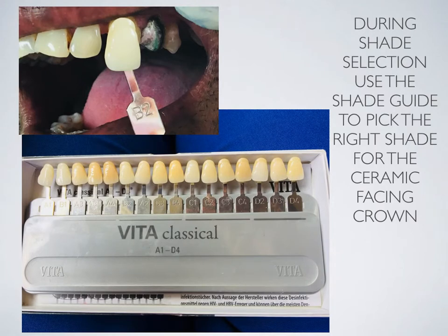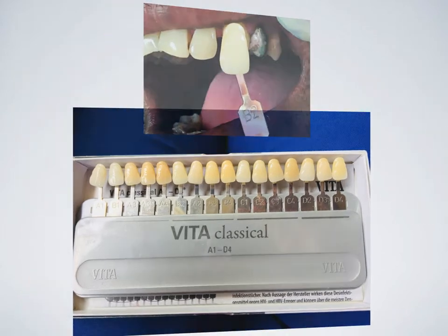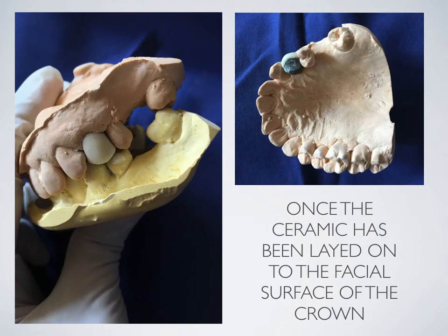During shade selection, use the shade guide to pick the right shade for the ceramic facing crown. Once the ceramic has been layered onto the facial surface of the crown, it appears like this.